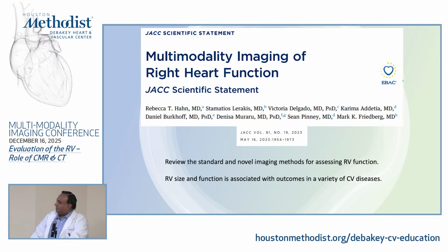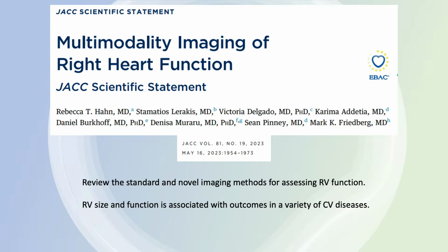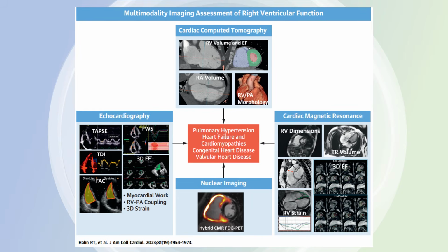So this is a nice review from 2023, which goes over the different modalities and how they can be useful for assessment of right heart function, from Dr. Rebecca Hahn. And so this is a nice review figure from that paper.